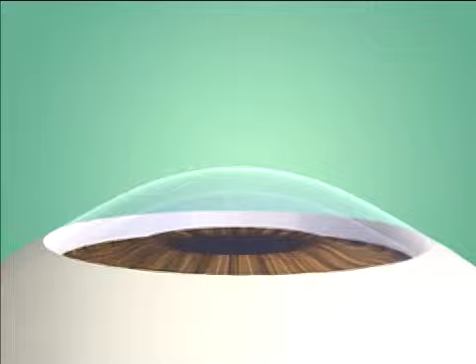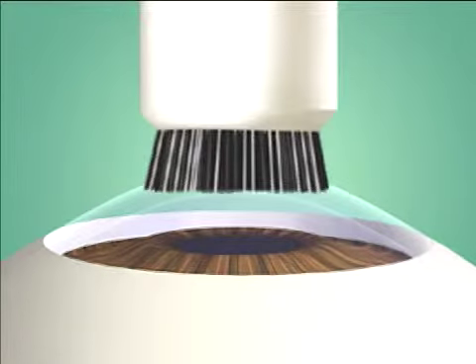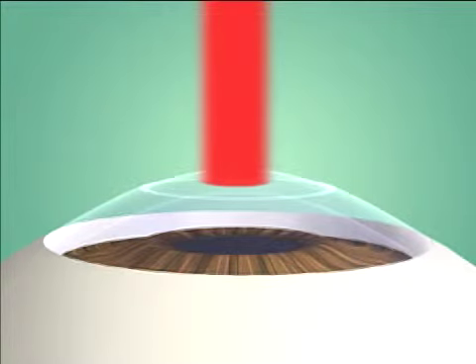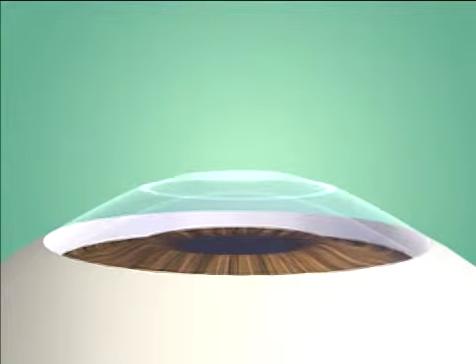With PRK, the epithelium or outer surface layer of your cornea is removed. An excimer laser controlled by a computer is programmed to reshape your cornea.